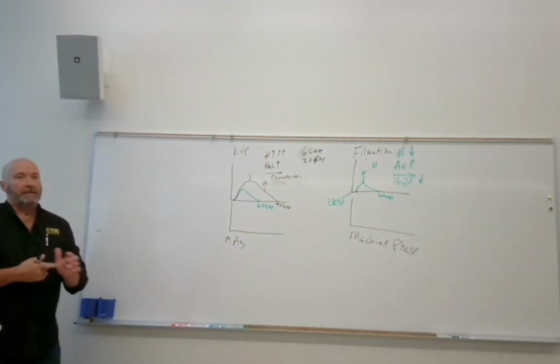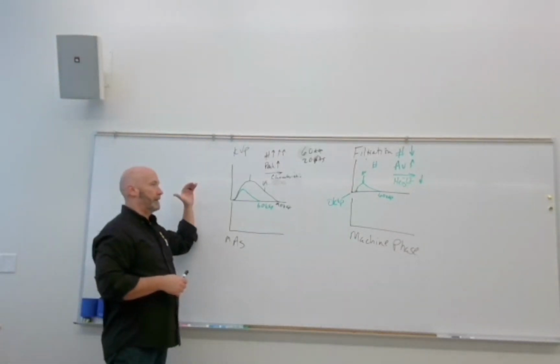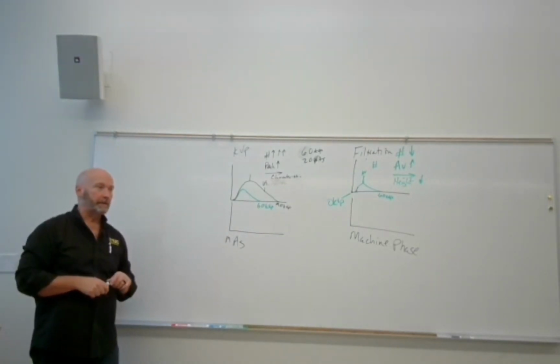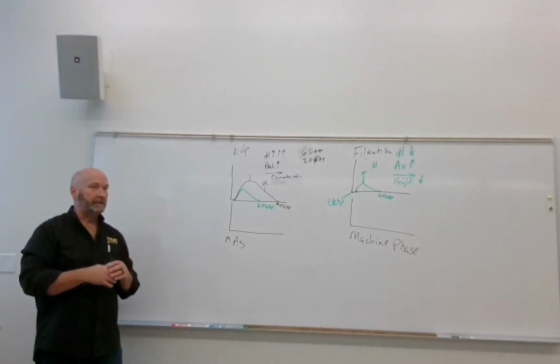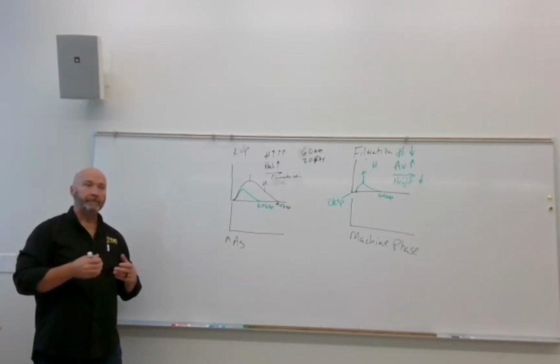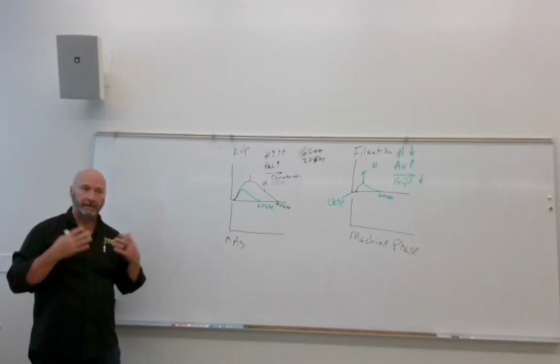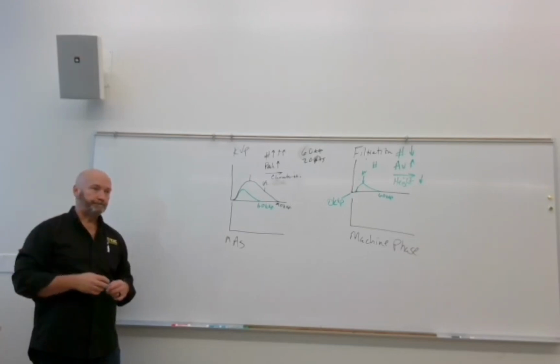All right. So historically, we've used kVp in technique adjustment for really only one thing, and that is if we have a pathology that increases the absorption of the X-ray beam, like a patient with acromegaly, be it because of osteopetrosis or because of a pituitary tumor, the bone growth, we might increase kVp.